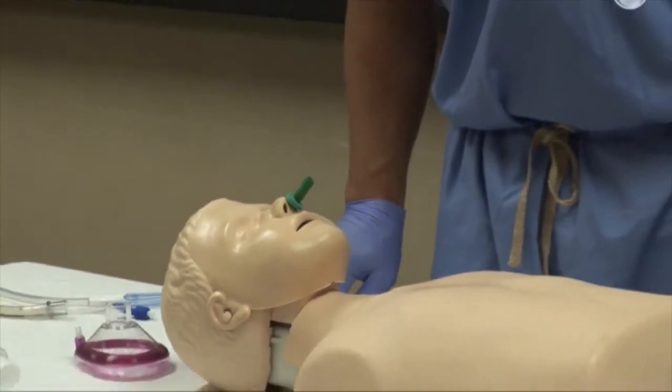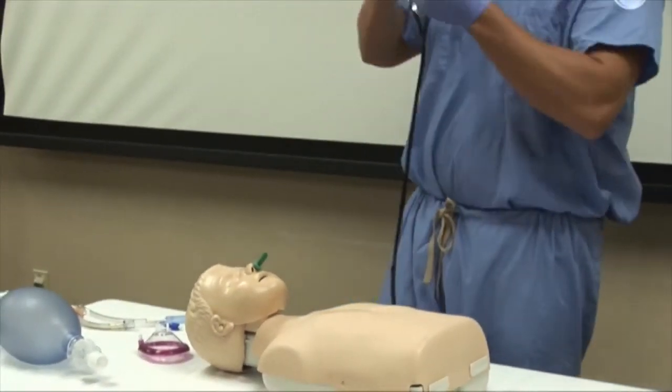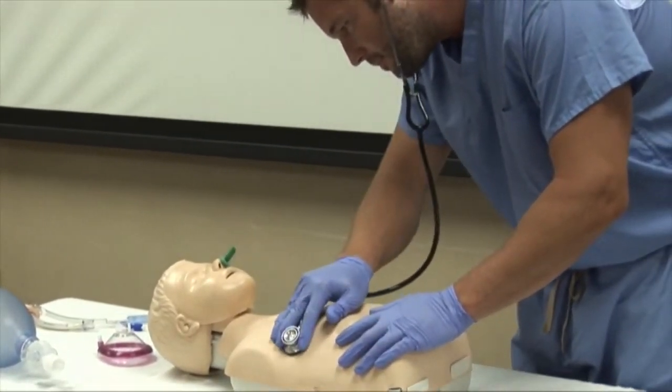After placement, listen to the chest and ensure that the patient is receiving adequate breath sounds. Now that we have our airway adjunct in place, we move to bag mask ventilation.